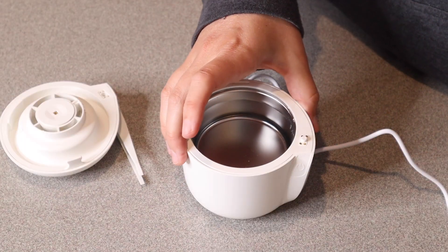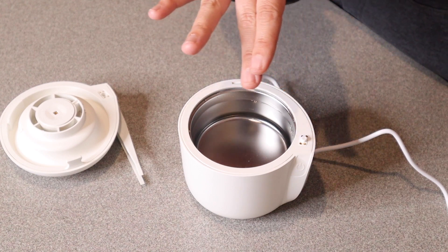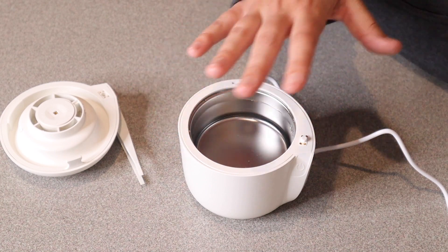Some of the interesting things about this specific ultrasonic cleaner is that it's going to be great for cleaning things like retainers, dentures, dental cleaning pieces, mouth guards, aligners, whitening trays, toothbrush heads, stuff like that.